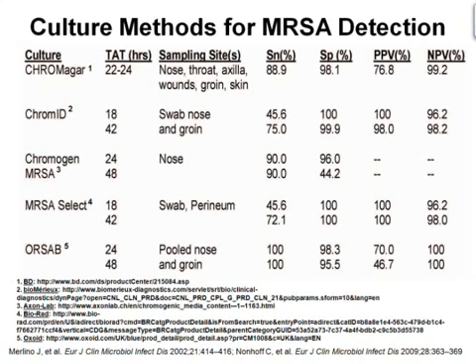One point I would like to make is that the sensitivities are lower than the specificities in most of the tests, indicating that these MRSA detection methods are better at ruling in MRSA infection than ruling out infection. An easy way to remember that specificity rules in and sensitivity rules out are the words spin and snout.